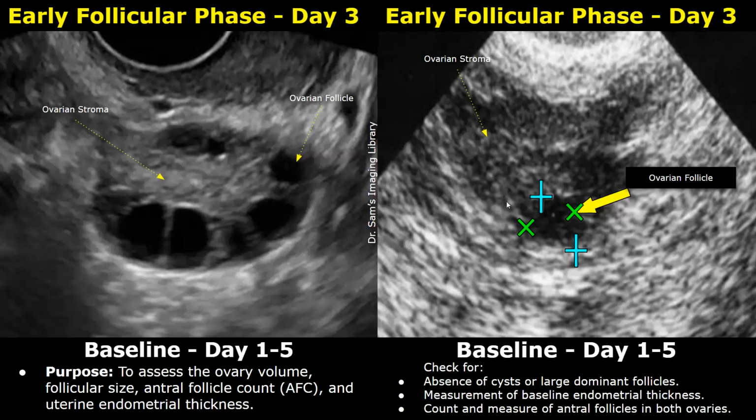In follicular monitoring, the baseline ultrasound scan is the first scan. It can be done when the patient is in the early follicular phase of the menstrual cycle, days 1 to 5 of the cycle. Day 3 is usually chosen to start the ultrasound monitoring.